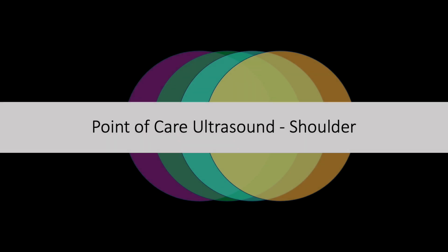This lesson will look at the basics of using POCUS to examine the shoulder. Shoulder pain is one of the most common MSK diagnoses encountered in the primary care office, and ultrasound can be a helpful tool for localizing injury, directing further imaging, or guiding diagnostic and therapeutic injections.